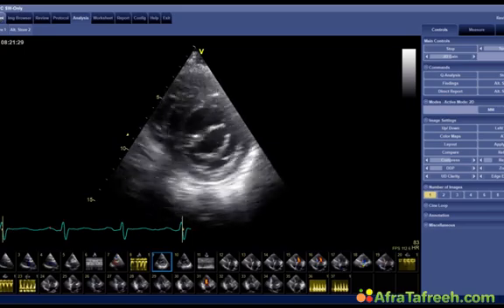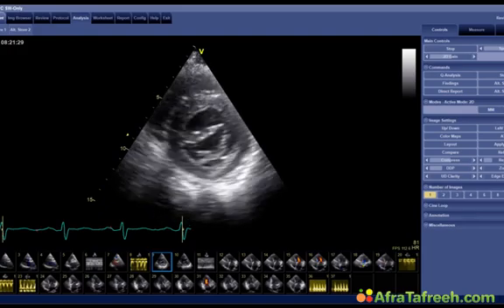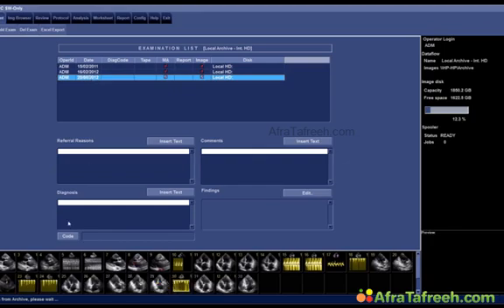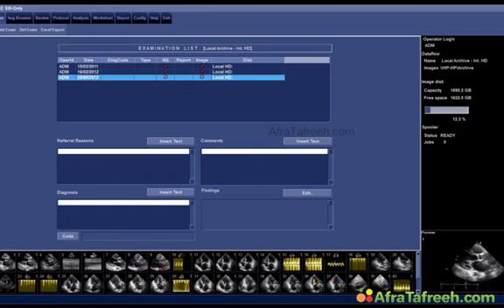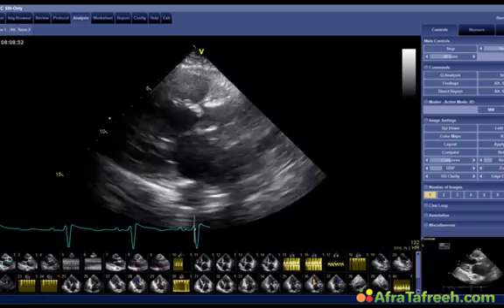And I did not hear anything from her. And then a few days ago, her daughter called me up and said she's really doing badly. She's in her bed, and she can't move around, and she has shortness of breath, and we have to do something. And so I brought her to the hospital, and this is the echocardiogram that I took only a few days ago. This is again the aortic valve.